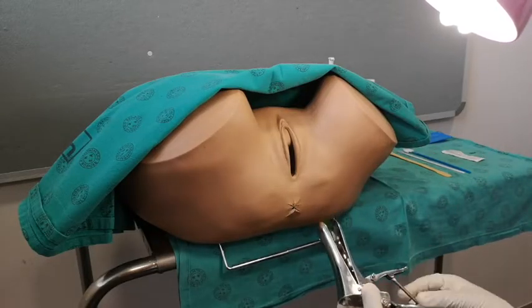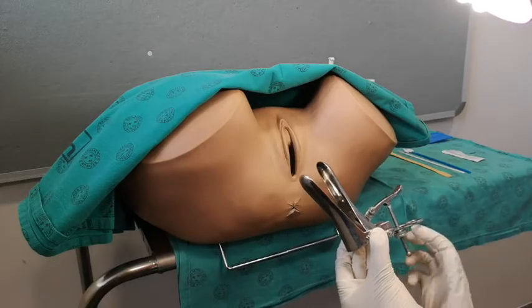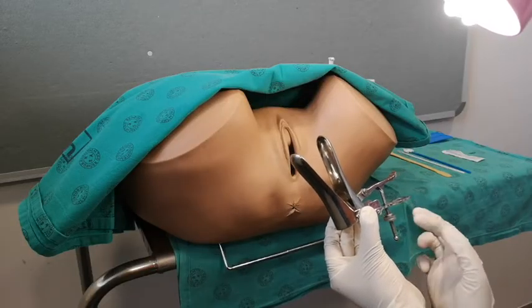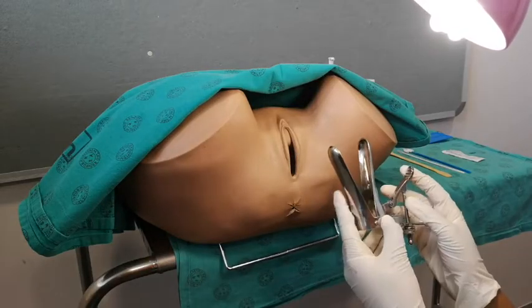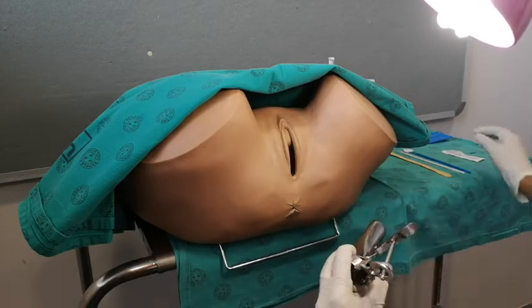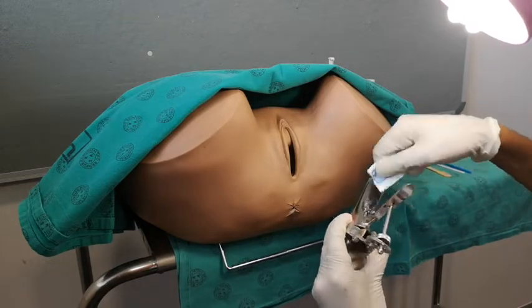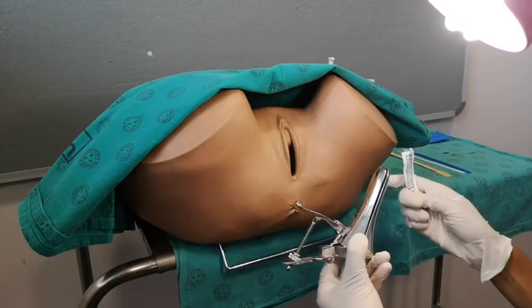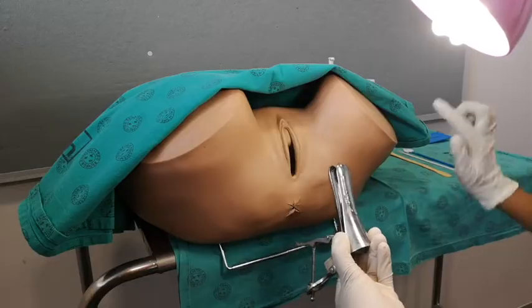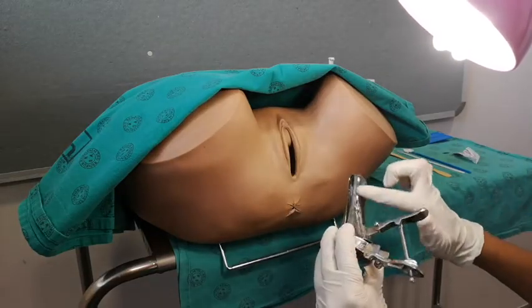Check that your speculum is functional before using it. Apply lubricant along the blades of the speculum, being careful to avoid the tip as this may contaminate your specimen. Newer guidelines suggest that you use water to lubricate the blades.